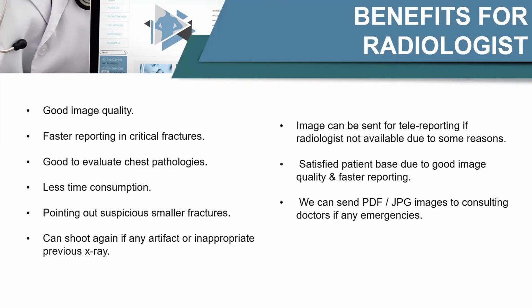We can shoot again if the first X-ray is inappropriate, or if there is some artifact. Image can be stored in the data, and then we can send it for telereporting also. So if at all radiologist is not present at the center, then it can be sent in PDF or JPG format to the radiologist, and he can report remotely. Next slide, please.